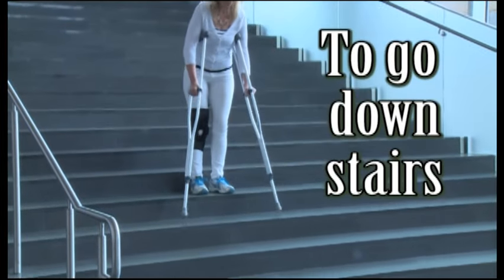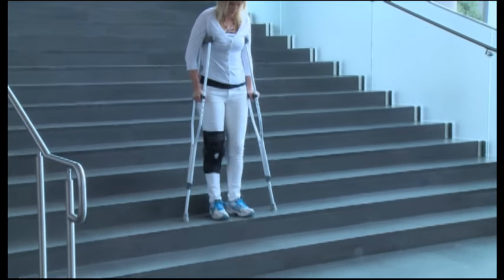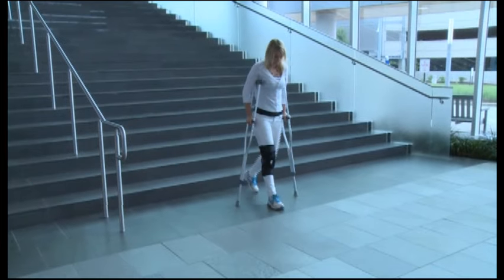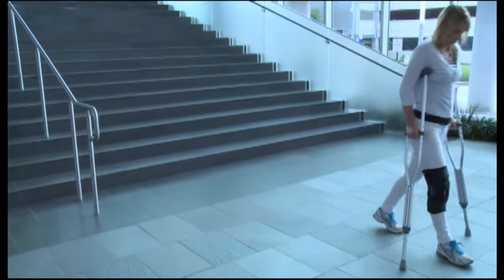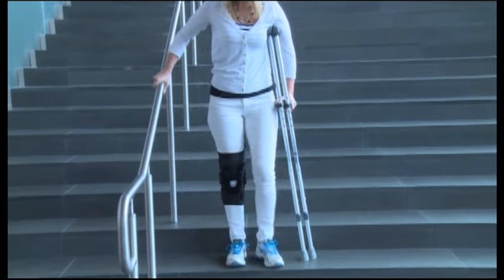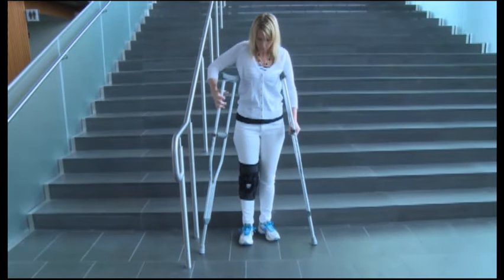To go down steps, start at the edge of the step keeping your hips beneath you. Place crutches on the lower step. Your injured leg goes down next. The healthy leg is last. Check your balance before you continue. Make sure you bend at the hips and knees to prevent leaning forward, which could cause you to fall. If there is a sturdy handrail available, hold both crutches under one arm and use the handrail with the other arm. Place crutches on the lower step, your injured leg goes down next, and the healthy leg is last.